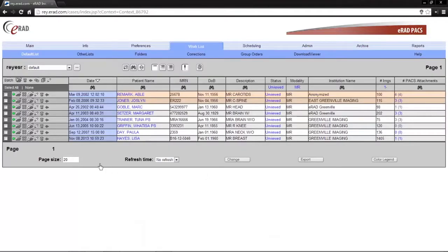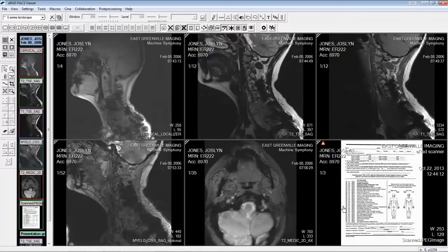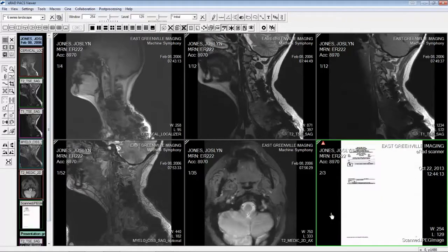The second place you can see scanned documents, which we already spoke about, is the patient folder. The third place you can see scanned documents will be right next to the images in the full diagnostic viewer. You will see them as a single series in a stacked format.